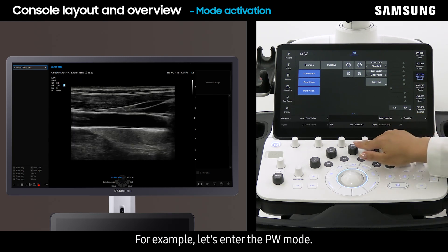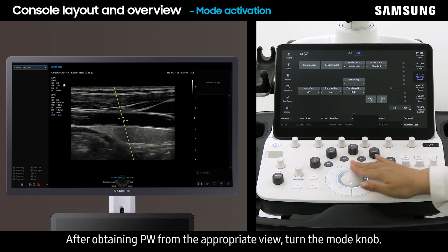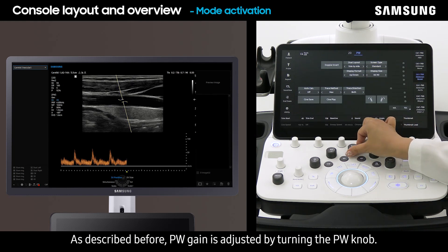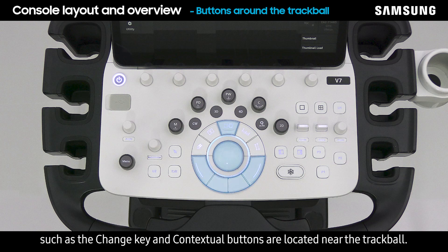For example, let's enter PW mode. After obtaining PW from the appropriate view, turn the mode knob. PW gain is adjusted by turning the PW knob. The trackball is located in the center of the control panel, and frequently used buttons such as the change key and contextual buttons are located near the trackball.